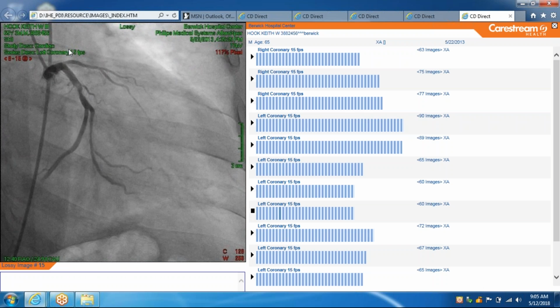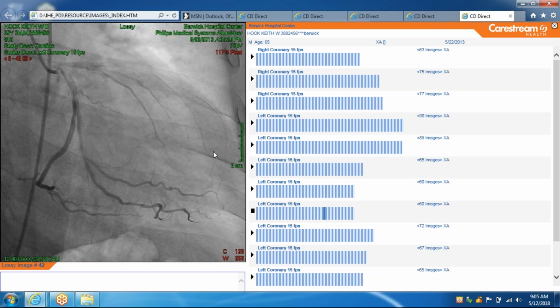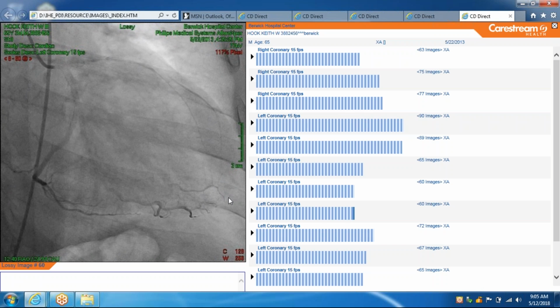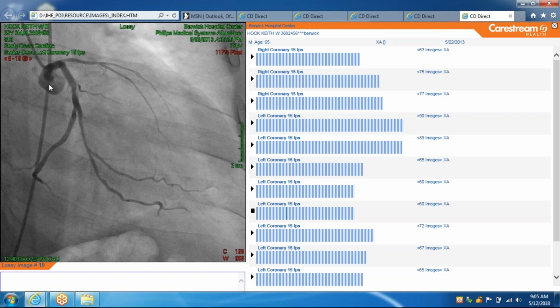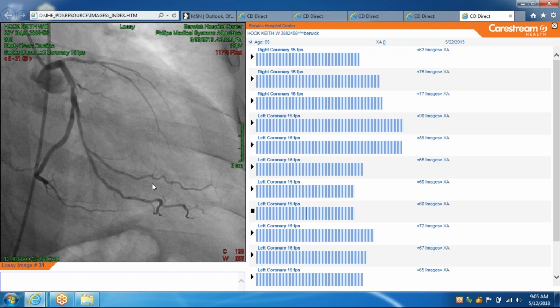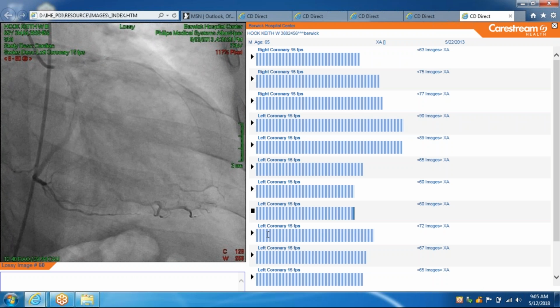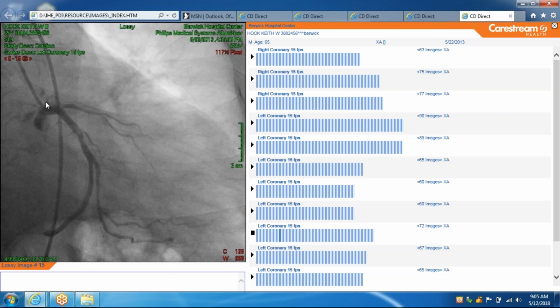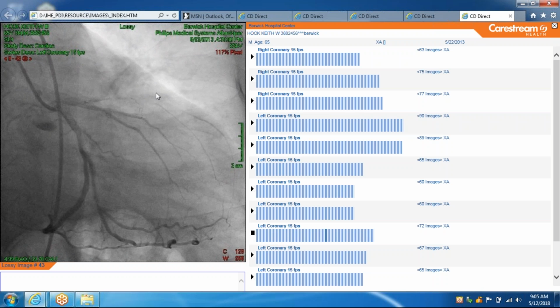Again, the LAD is supposed to come down here. So you see there's a paucity of vessels here. Something in the mid circ. Then when you look again, another view, the so-called spider view, the LAD is supposed to come right there and come down here.